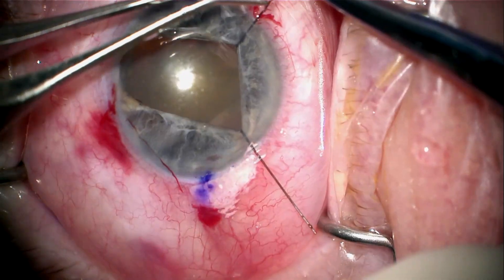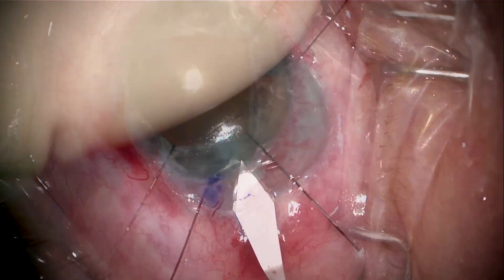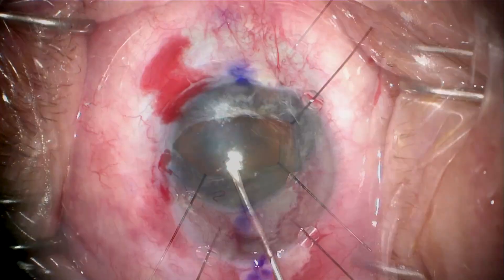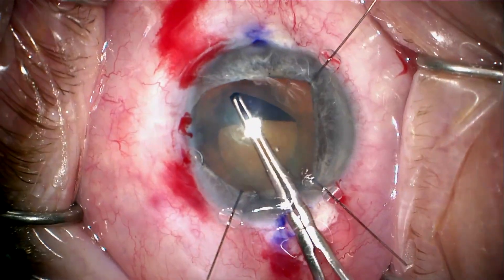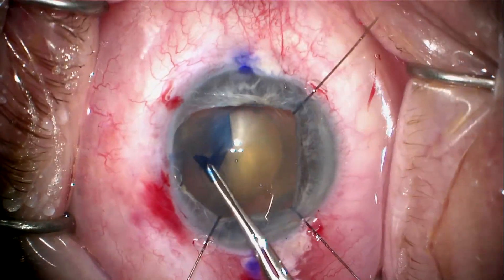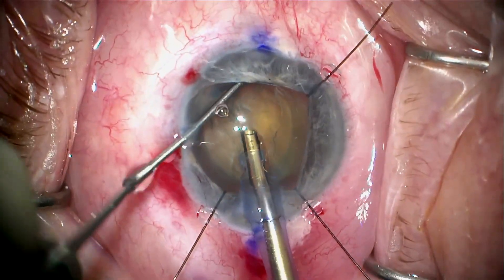Here we're placing some iris retractors to expand the pupil enough so we can do safe cataract surgery. I suspect that he has zonular weakness in the area of the trauma superiorly, which is on the left side of the video, so we're going to be very careful about that as well.